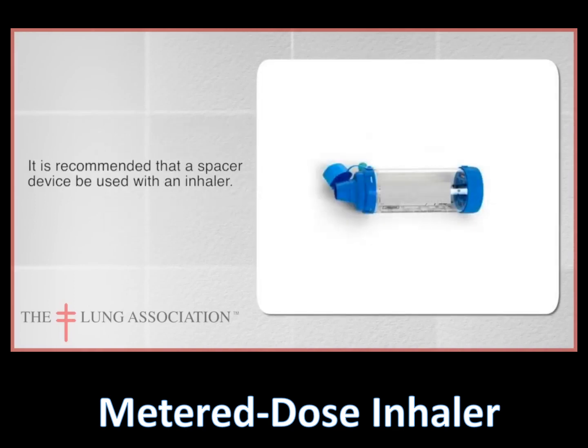It is recommended that a spacer device be used with this type of inhaler to help improve the delivery of medication to the lungs. These are available at your local pharmacy.